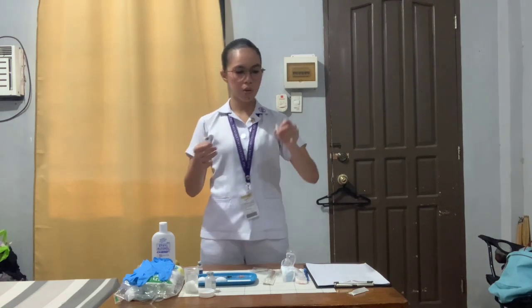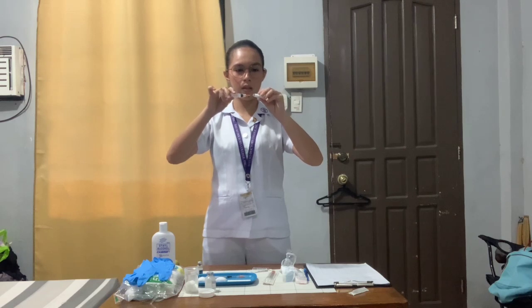So we're just going to tilt the ampule to get all of the medication. So now once it's done, we are going to discard this ampule into the sharps, making sure that we dispose of it in the right receptacle.